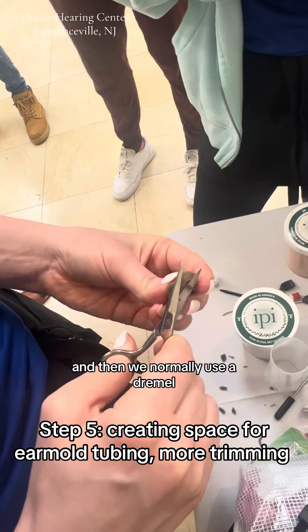Normally we use a Dremel, but we do not have a Dremel with us. Yeah, there are a lot of things we don't have on a humanitarian trip — it's all good. You do with what you've got. So we're going to thread — we're going to put the tubing into the mold and it's going to follow the path that we created. We're going to pull it through. This is a tubing lock so that our little girl doesn't pull the tubing out. All of this looks so familiar — I can see that you guys look very much alike. Thank you!